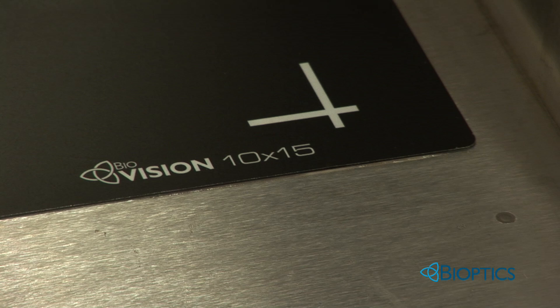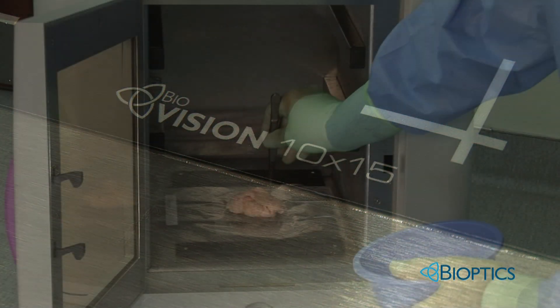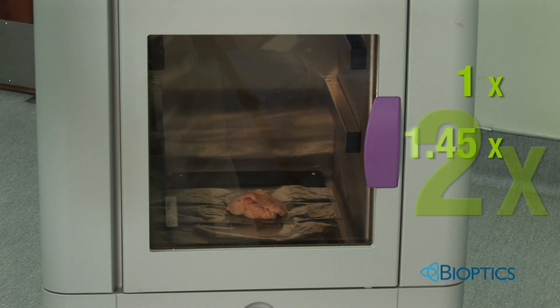The 10 by 15 centimeter detector can accommodate even the largest specimens. The larger detector allows you to use magnification without having to move the specimen from side to side. We're able to magnify some very fine nuances in the tumor and allow us to see that we have complete resolution of the problem.